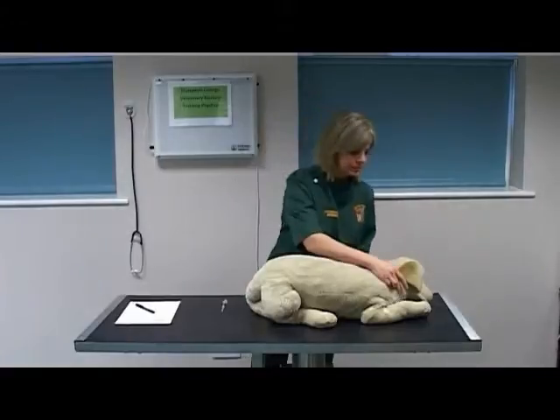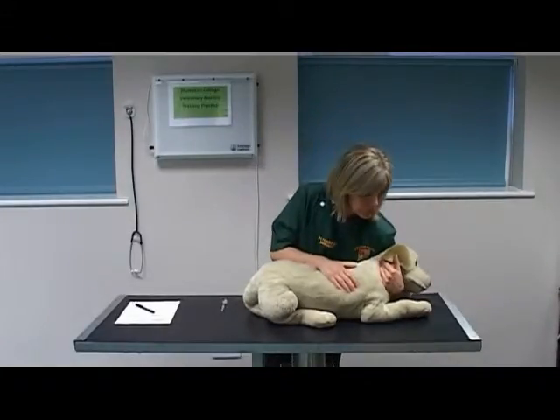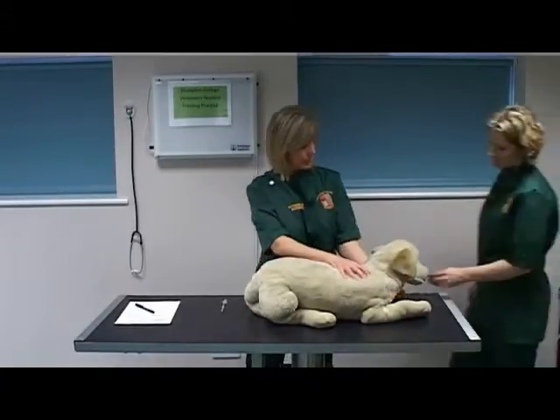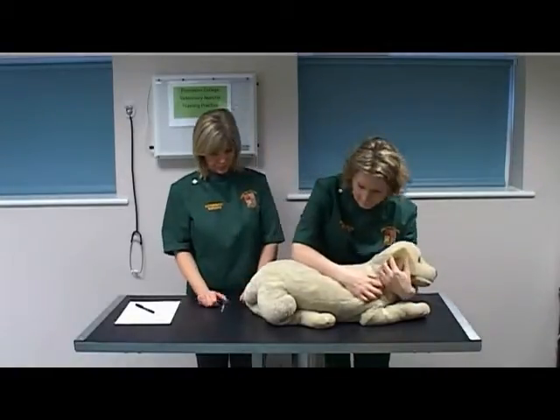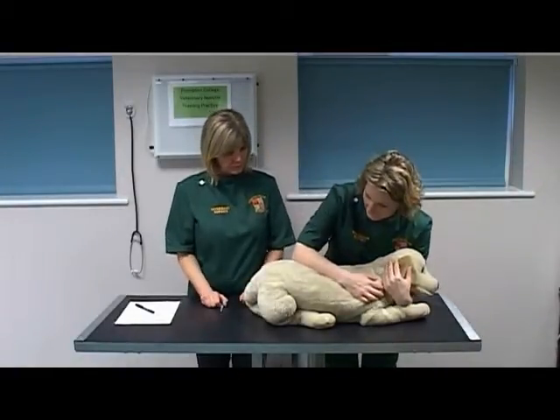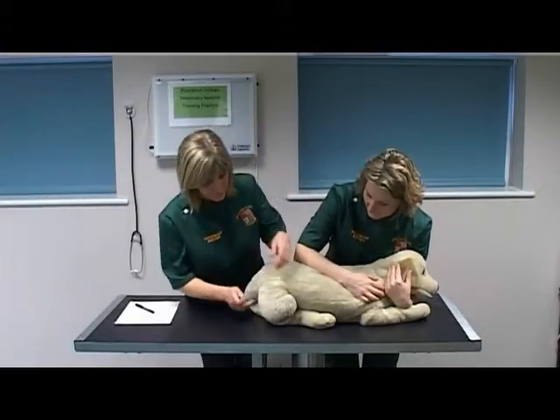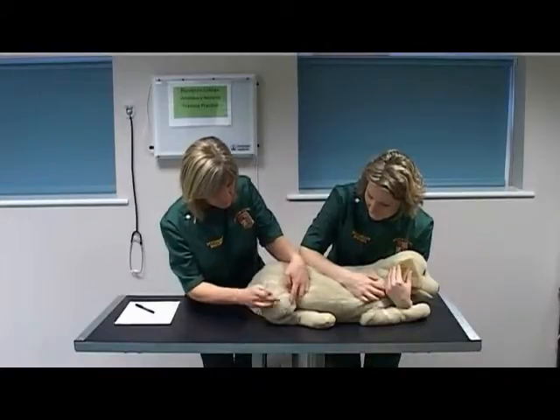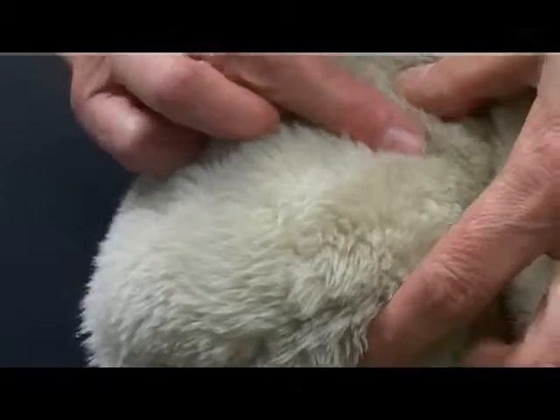Instruct an assistant how to restrain the dog effectively. Select the appropriate injection site — in this example, use the quadriceps muscle.